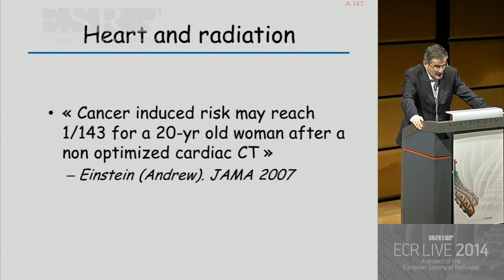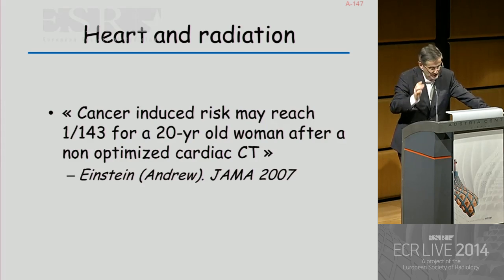There might be a risk in cardiac CT with dose, especially in young ladies, very young. It has been stressed by Einstein in JAMA 2007, and the risk might be up to 1%, which is very high.